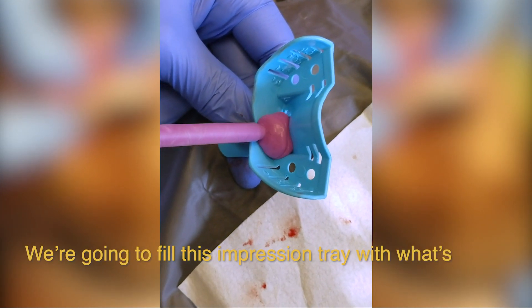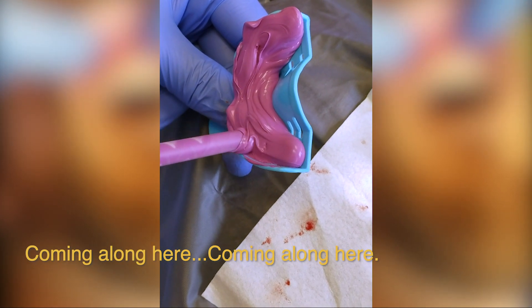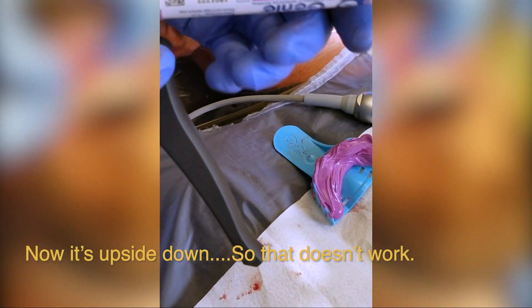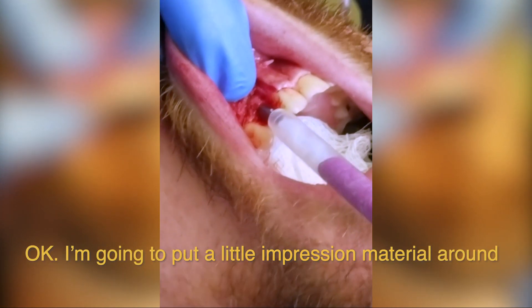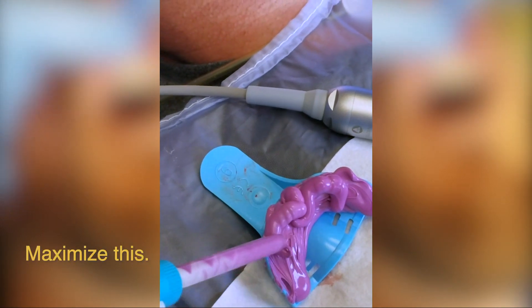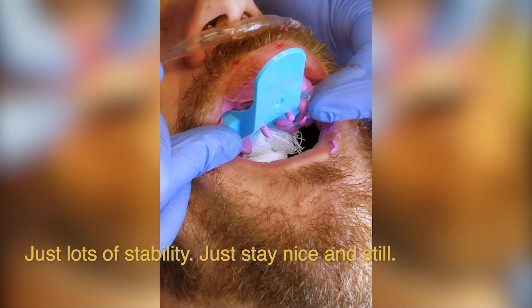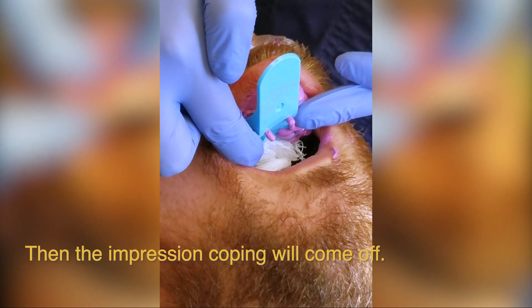I'm going to fill this impression tray with what's called PVS, or polyvinyl siloxane impression material. Just filling this tray up, going along here. Now I'll switch out my gun, get some more. I'm going to put some impression material around this thing — this is just fun for me. Impression tray goes in and sits right like that. Put a finger here and here for lots of stability — stay nice and still. We're going to let that set for about two minutes and 30 seconds. Then the impression coping will come off and we'll put a cover screw on.